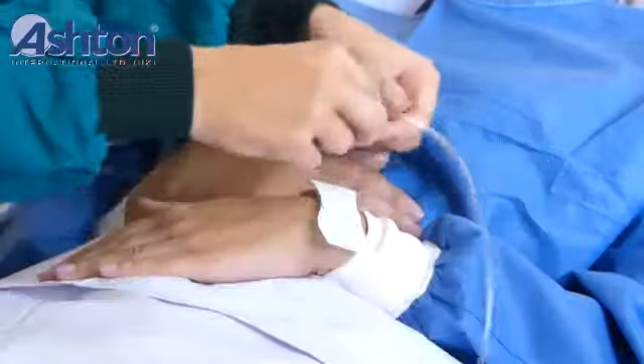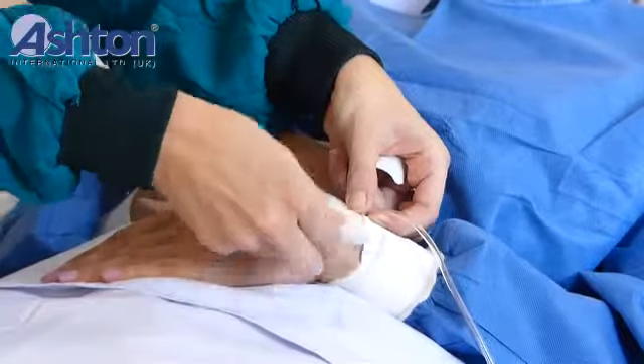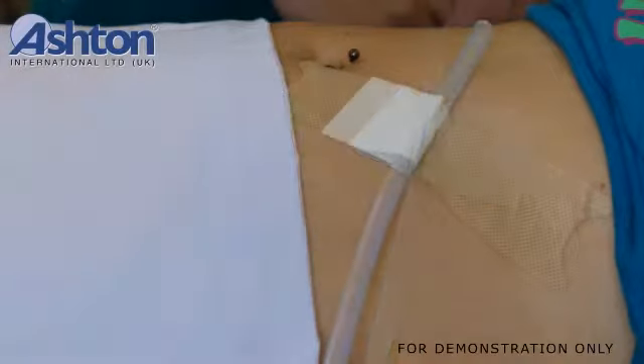AshFix allows easy repositioning without removal. It can open and close repeatedly without damage. Velcro straps can be opened and closed as needed, which ensures that the fixing system remains on the patient for a few days.